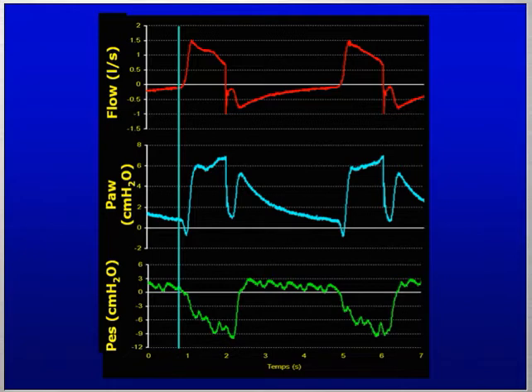This is another example where you see a big difference between what the ventilator is delivering, and you see here the beginning of the breath and the end of the insufflation, and you see that it is different from the end of inspiratory effort of the patient. That's why you see this weird curve on the airway pressure. The patient wants more inspiration, more inspiratory time than delivered by the ventilator based on flow cycling criteria.